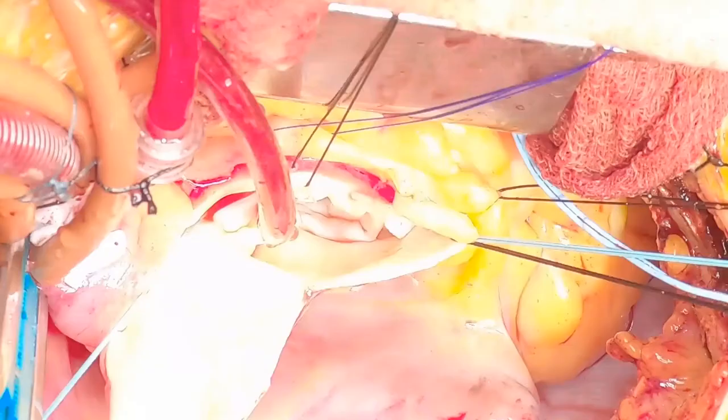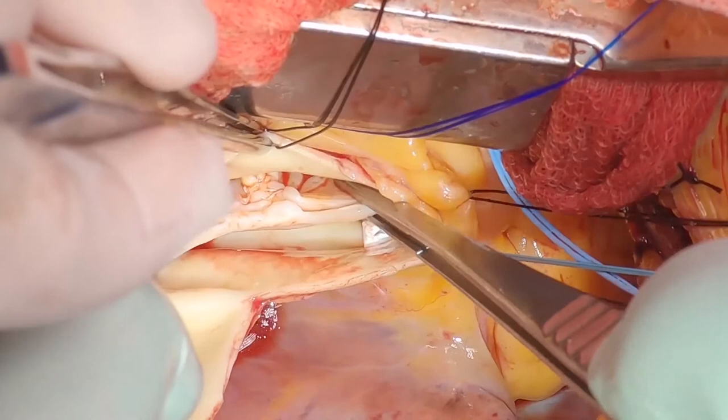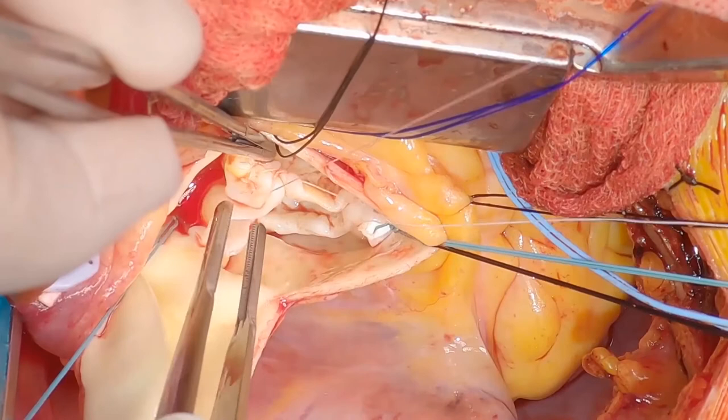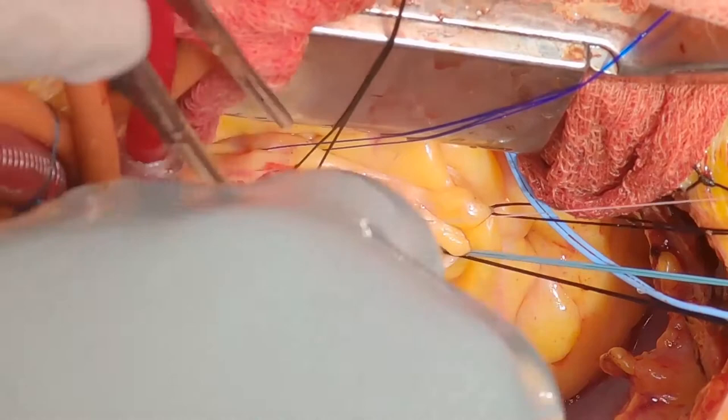The next step is to assess how much I still need to plicate. You never want to overdo it because then you end up with aortic valve stenosis. I use a horizontal mattress suture because it's less likely to tear out, and I haven't seen a tear out. You're buttressing more tissue than with a running suture. Tying that down should be your final stitch to get that leaflet symmetrical.